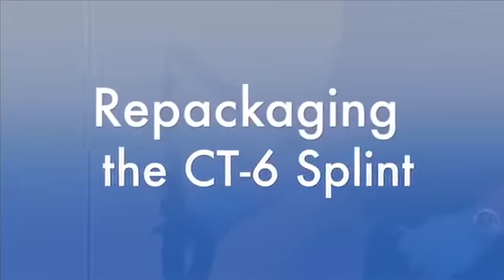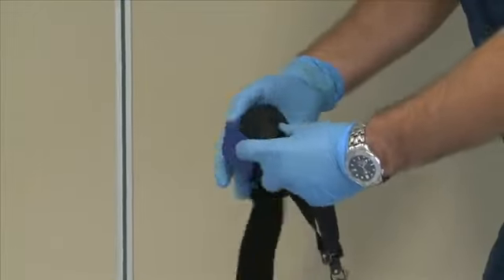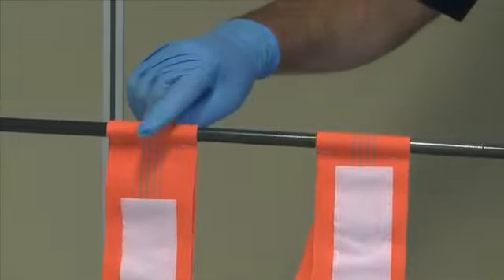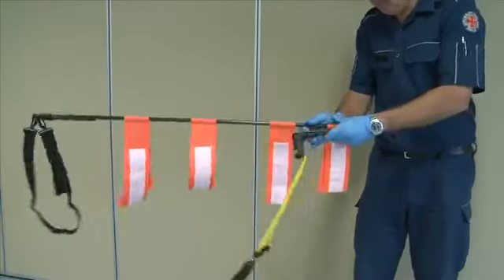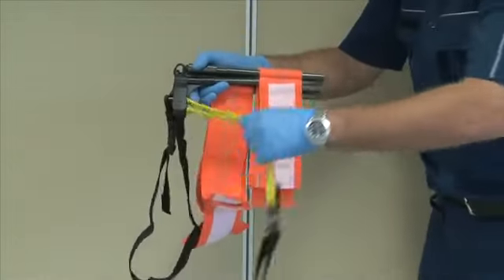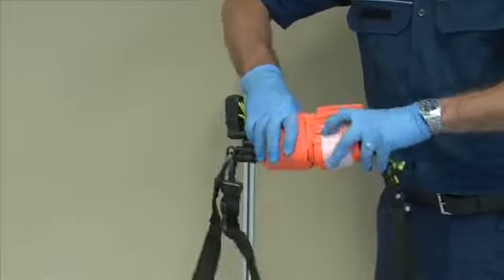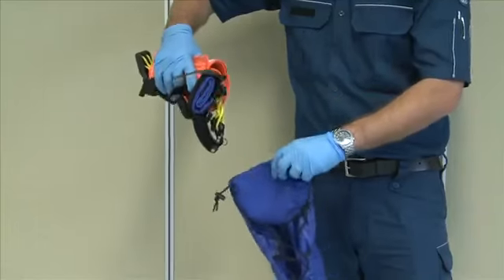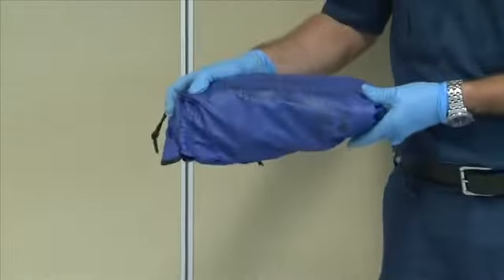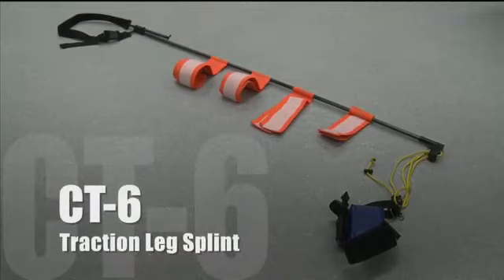Re-packaging the CT6: Re-attach the ischial strap to the splint. Re-roll the ankle strap and secure it with velcro. Ensure the straps are straight and none are hanging over the connected segments. Pull each segment and fold it back on top of itself until you get a tight little bundle. Pull the ankle hitch through the unit and roll the unit. Best results are achieved when the straps are stacked in pairs and the ankle hitch is free of the roll. Place the CT6 back into the bag, ankle hitch side first for easy deployment. Make sure you get your hands on one and have a practice prior to deployment.